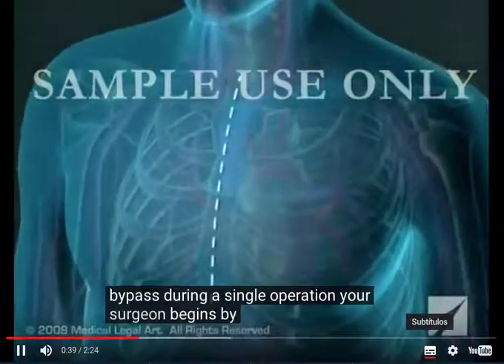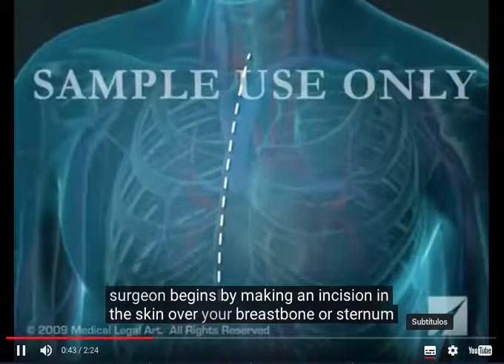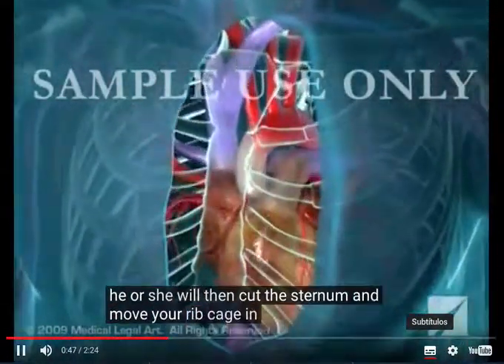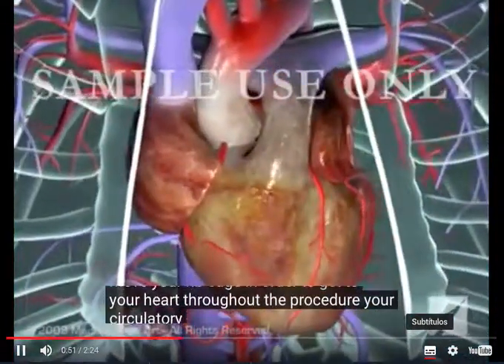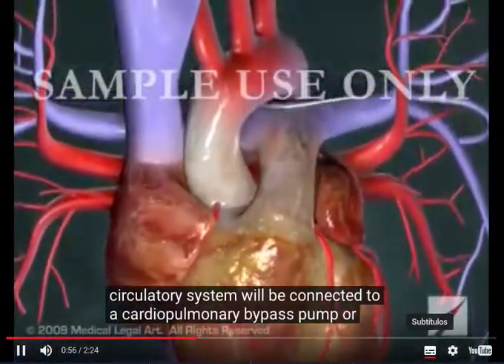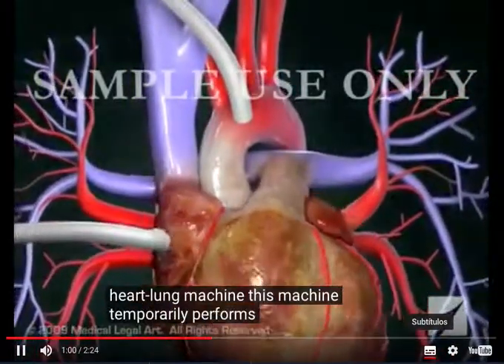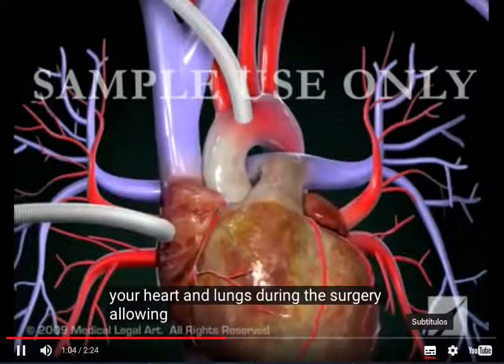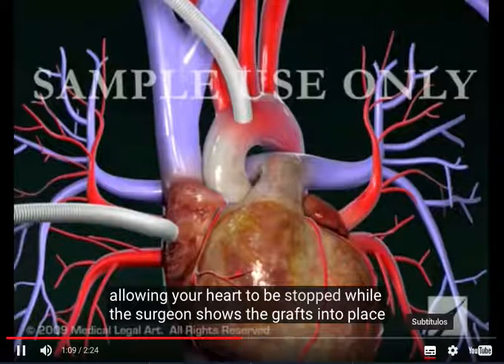Your surgeon begins by making an incision in the skin over your breastbone, or sternum. He or she will then cut the sternum and move your rib cage in order to get to your heart. Throughout the procedure, your circulatory system will be connected to a cardiopulmonary bypass pump, or heart-lung machine. This machine temporarily performs the functions of your heart and lungs during the surgery, allowing your heart to be stopped while the surgeon sews the grafts into place.